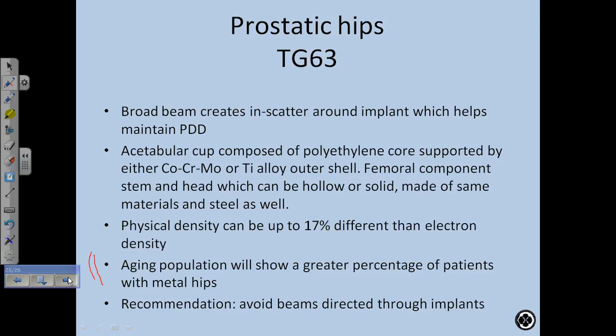But there are techniques, and I don't know if Theo's going to cover heterogeneity corrections in planning. Has he said that? Not yet. Okay, well, just ask him about it. So there are techniques to get around that, or to mitigate that, I should say.